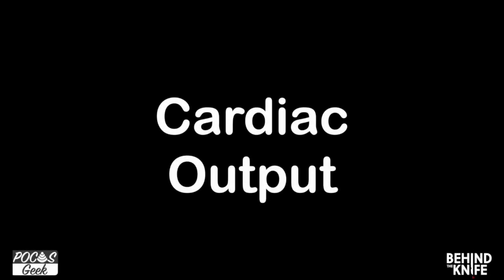So a more advanced scale that we can do, and has good literature to support it, is predicting the cardiac output and using that calculation after intervention to see if the patient is fluid responsive. So this is not an easy thing to do. It can be hard in our critical patients, but has some good data behind it. And we're going to go through that right now.